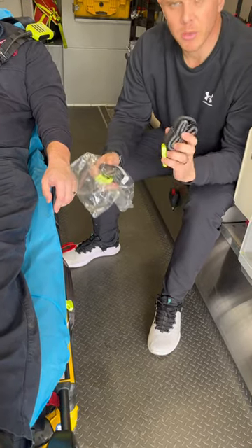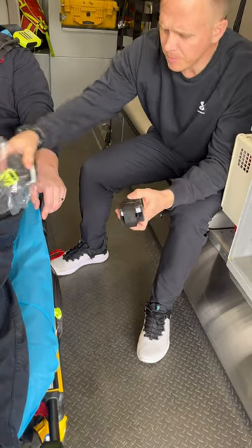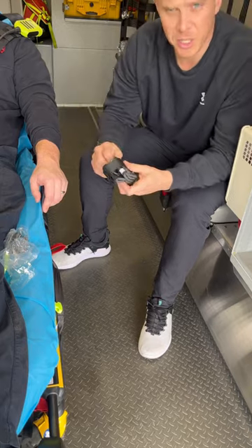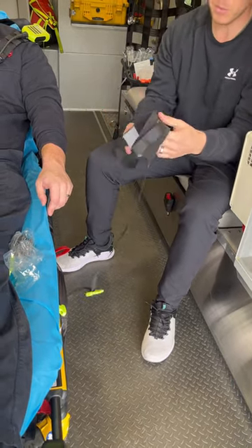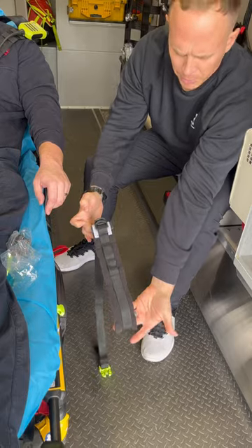Hey everybody, on this video we're going to go over the disposable cuff and how this is applied. So in the unfortunate event restraint is needed, simply remove the cuff from the storage pouch. It comes pre-looped.